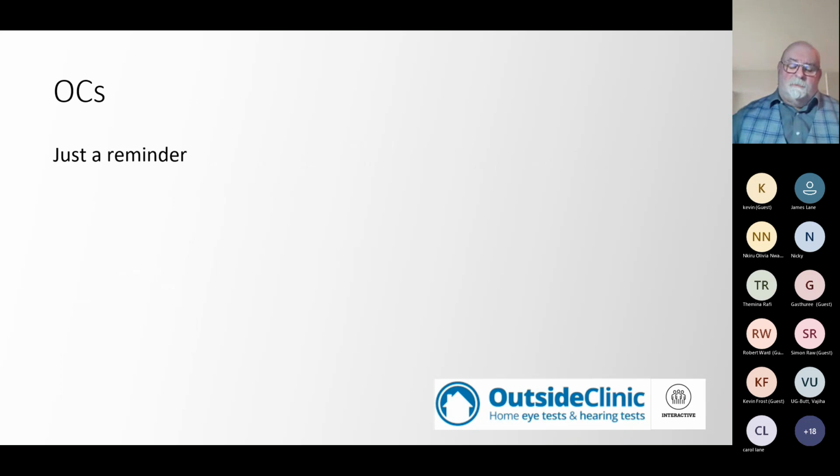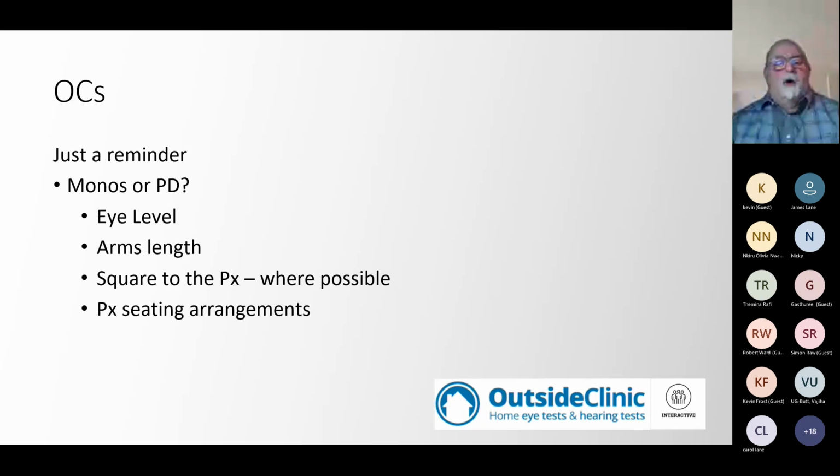So the optical centers, and please, please, please, I'm not trying to say that we need to be taught how to take the optical centers. What I'm trying to do here is do this as a reminder and just make it relevant to a patient in a home environment. So monos or PD, I prefer the monos. If you prefer the PD, that's absolutely not an issue as far as I'm concerned, but we do need to take into account the patient's posture.